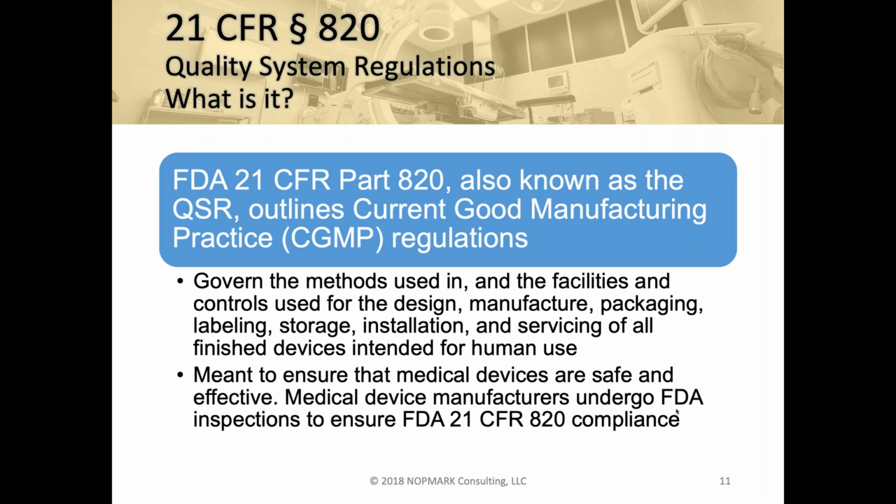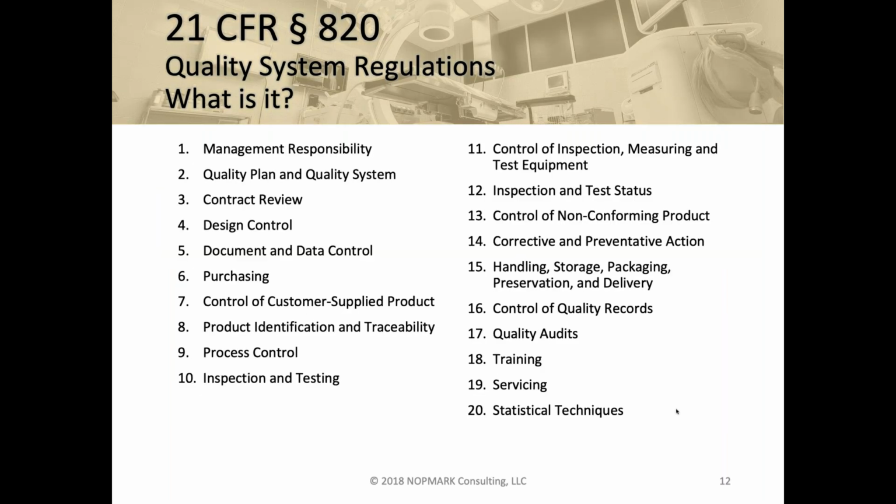All of these areas may have software. So it's not just the main design aspect; many of these areas can have software. In all of these areas related to the good design, manufacture, support, and life cycle of a medical device, including medical device software, this is the regulation within the US that dictates what must be done.